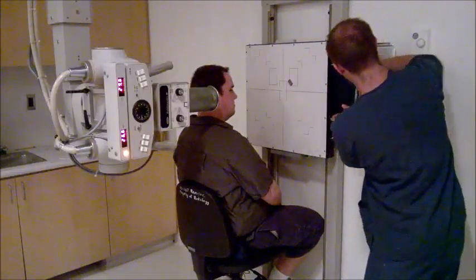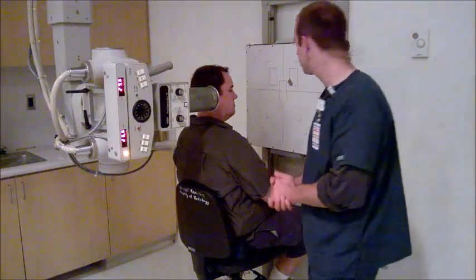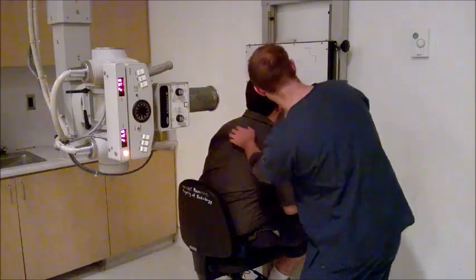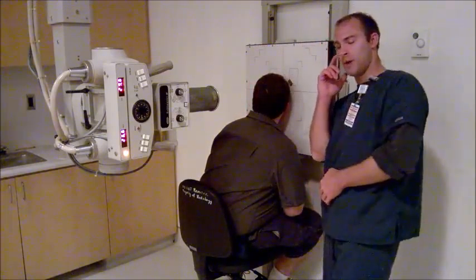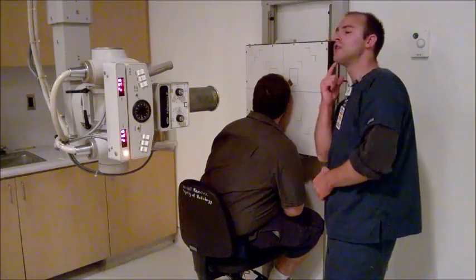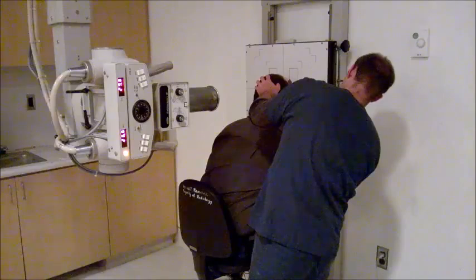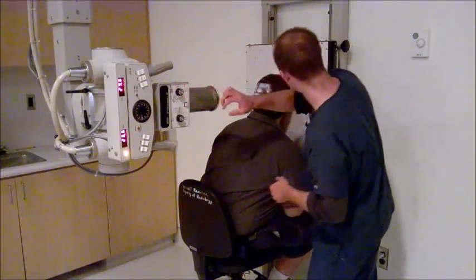I'll come back here and do my last one, which is the 3-point landing Rhese method. So I would, sir, could you put your right side, yep, right side against the board right there. Now what the point about this is put the cheek, the chin, and the nose. So we're gonna have your cheek, nose, and chin against the board, make it a plane.